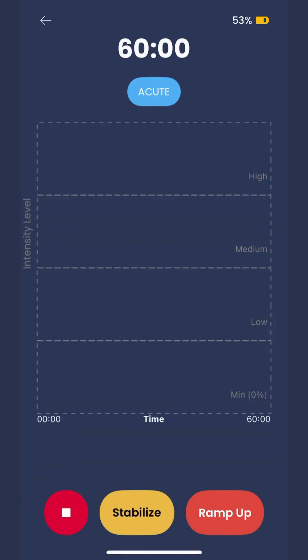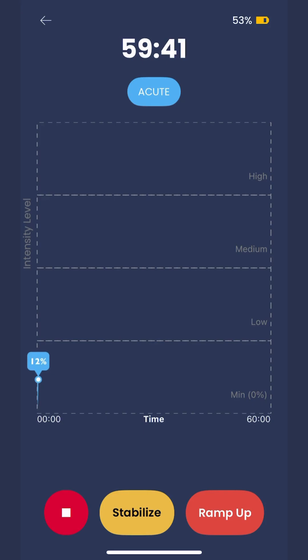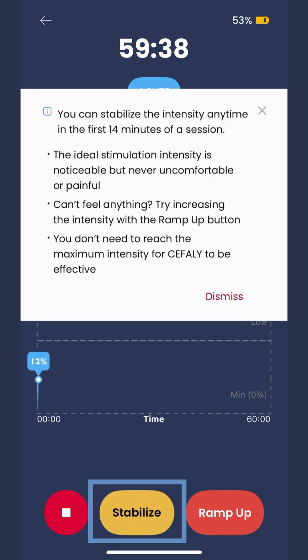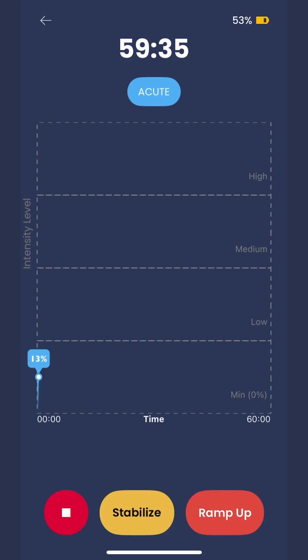The stimulation intensity gradually increases over the first 14 minutes. When you're ready to stabilize the intensity, hit stabilize and you'll stay at that intensity for the rest of the treatment. You can also stabilize the intensity by pressing the device button once during the treatment.